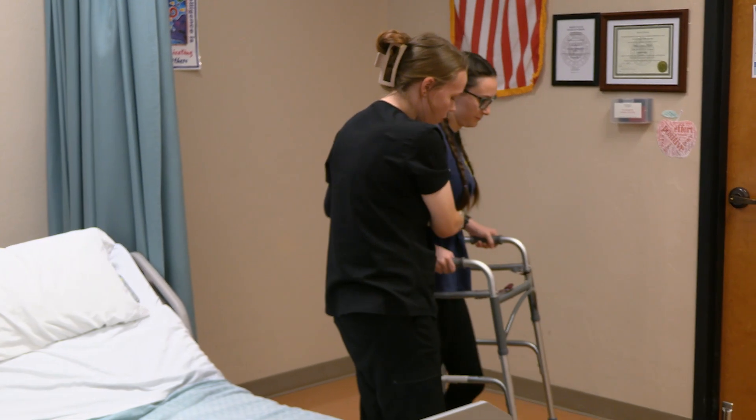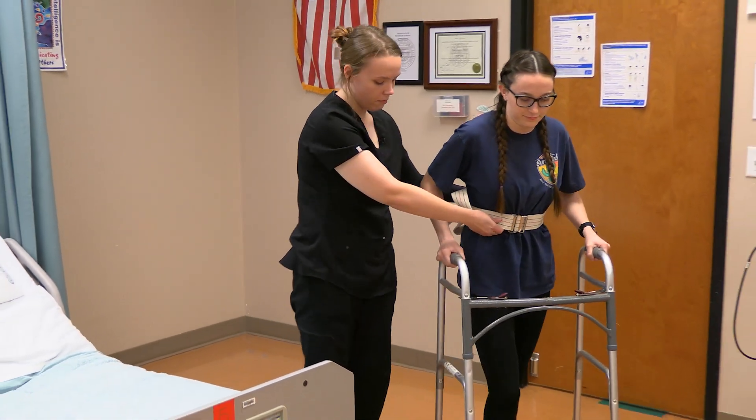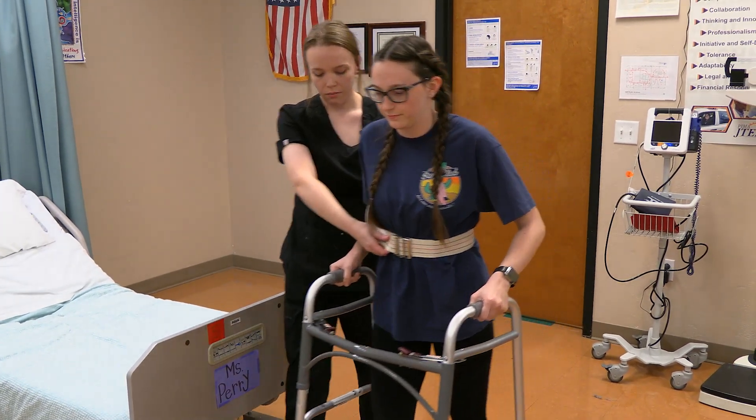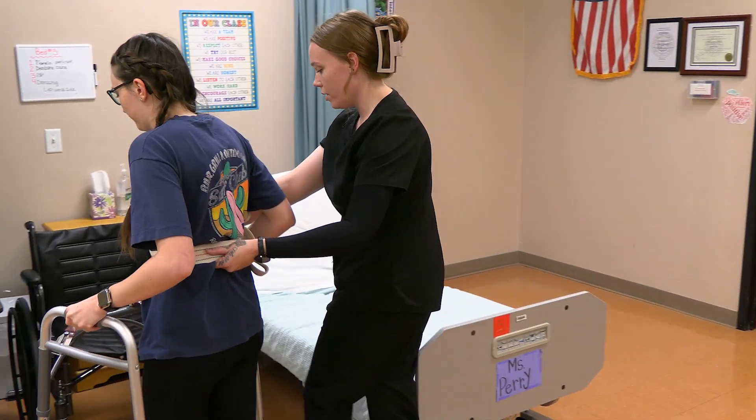One, two, three, four, five, six, seven, eight, nine, ten, eleven, twelve, thirteen, fourteen, fifteen.